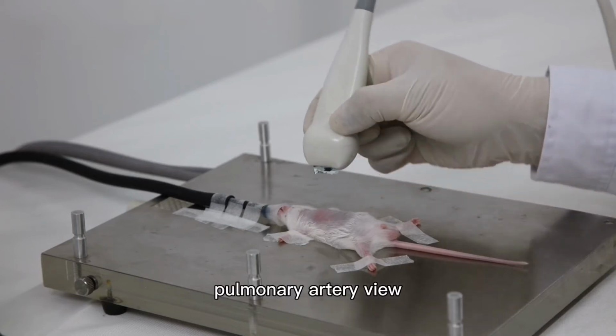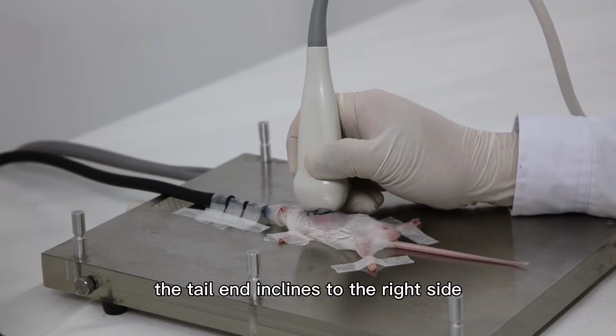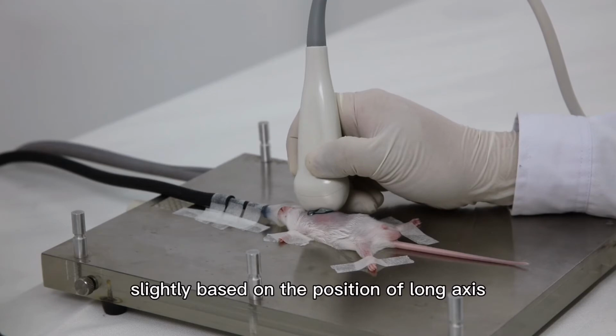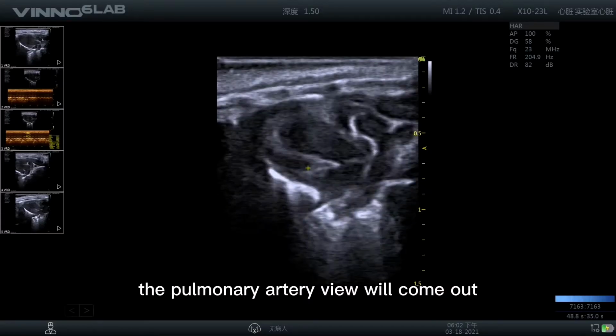Pulmonary artery view. The mark rotates to the left shoulder slightly. The tail end inclines to the right side slightly based on the position of long axis. The pulmonary artery view will come out.